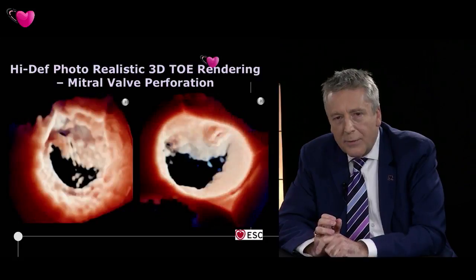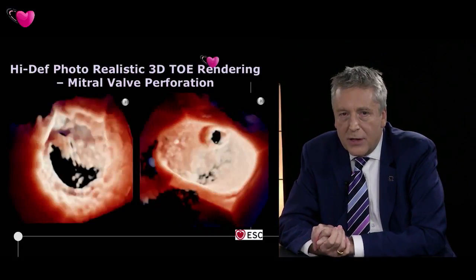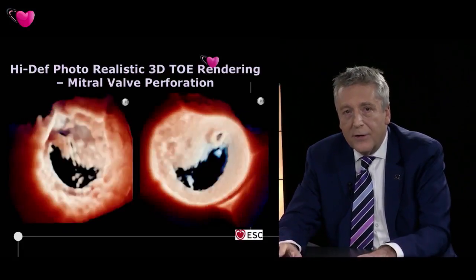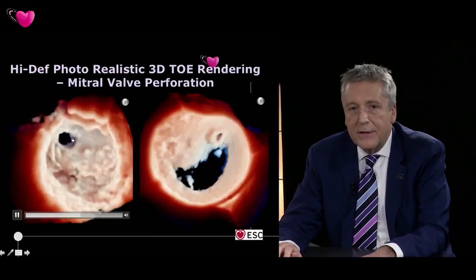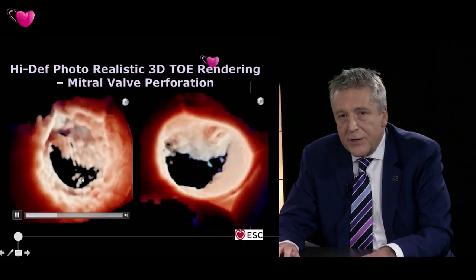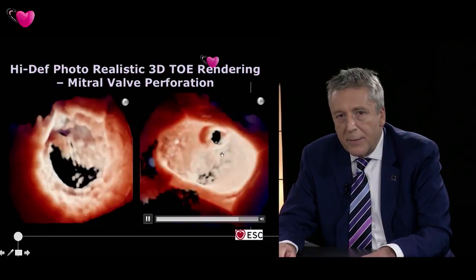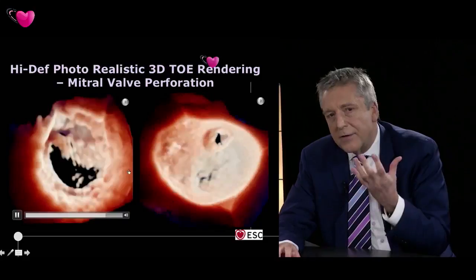And I want to show you some of the nice advances that are happening in 3D imaging of valve disease, but also other structures as well. And this is a high-definition photorealistic rendering of a 3D TE data set. And this is actually a mitral valve viewed on the left-hand side from the left atrium, so the surgical perspective, and on the right-hand side from the left ventricle in a patient who's got a perforation secondary to endocarditis. So you can see how this looks very, very realistic.